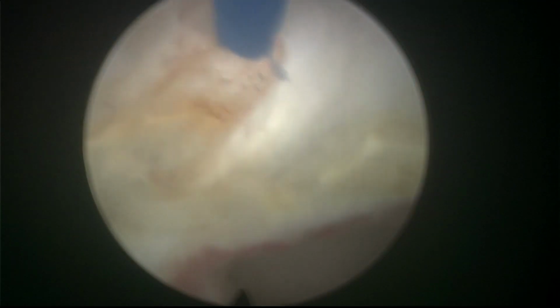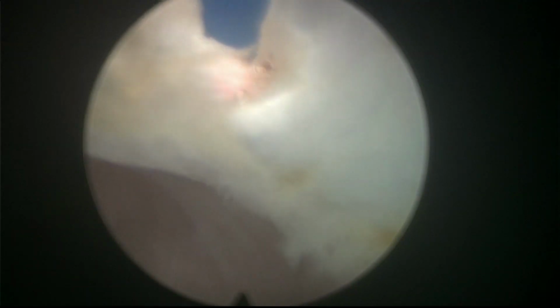And everything you have to do after that is to go around the adenoma, trying to evaluate if the plane is correct. You have to go a little bit deeper, or if you're already going deeper and you have to correct your aiming so that you remain inside.